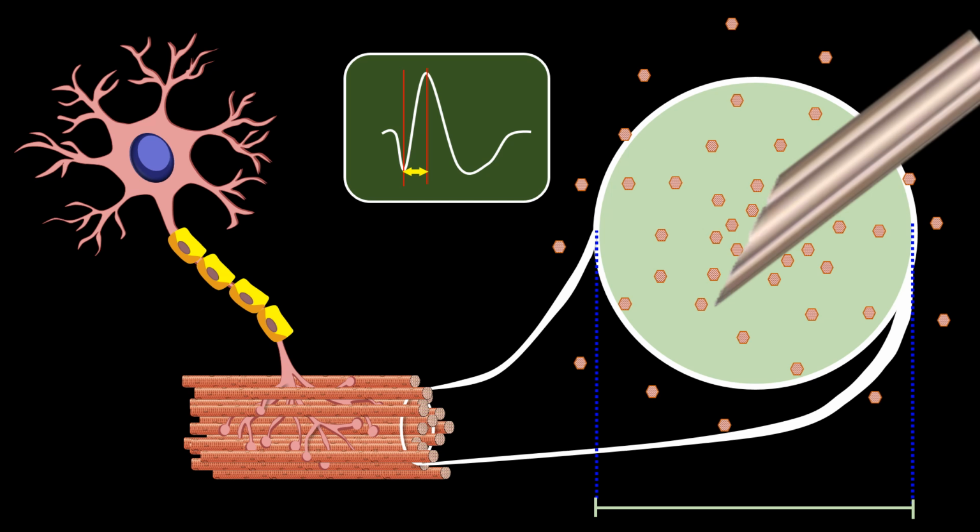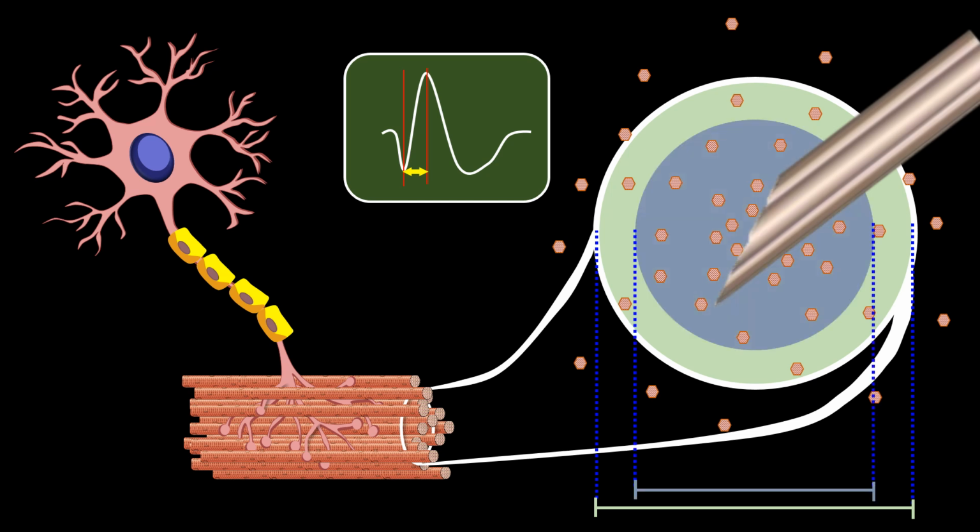Duration is a good index of the motor unit territory and is the parameter that best reflects the total number of muscle fibers within a motor unit. The area of the negative potential is determined by the muscle fibers within a 4 mm diameter circular area, as you can see in this frame. Here, the area is colored sky blue.